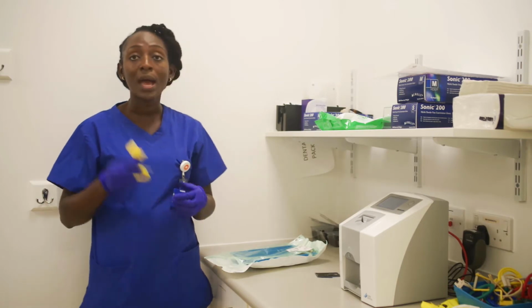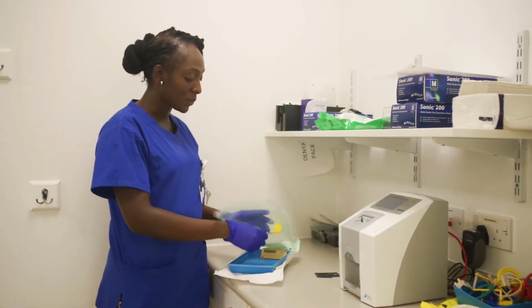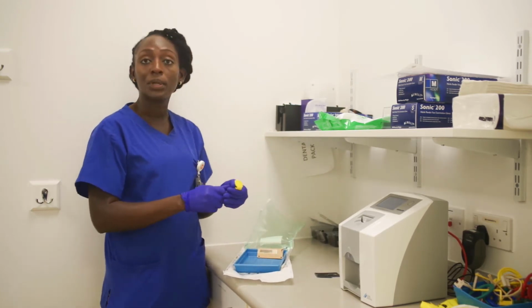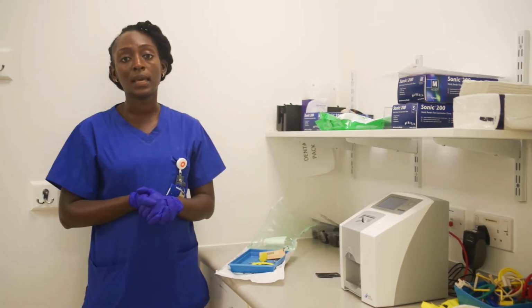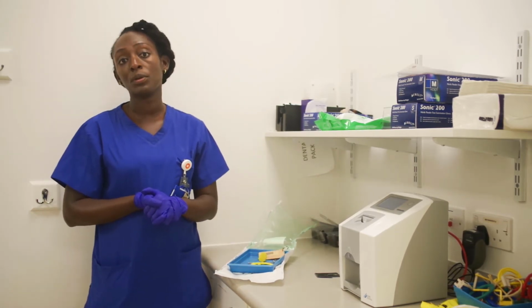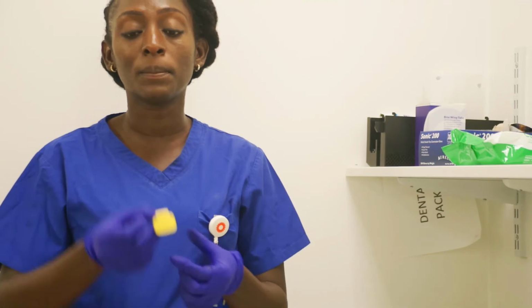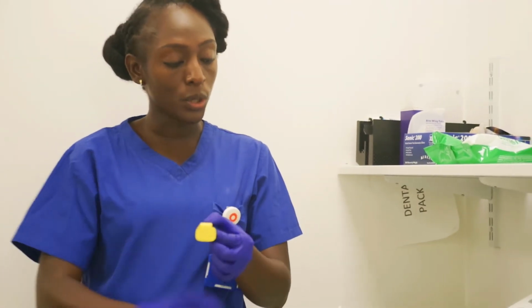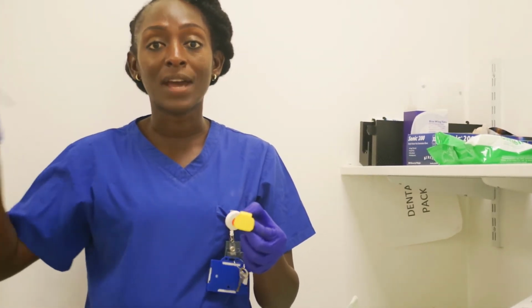So I'm going to show you how to assemble the posterior holder. Oftentimes they'll come packaged like that, but I'd advise that you disassemble everything. Okay? Let's say you want to take a PA or a periapical of the lower right 6. Good. So for a lower right 6, you'd want to hold the bite piece down because you're taking a lower tooth. And what you do is you place the metal rod on the right hand side.